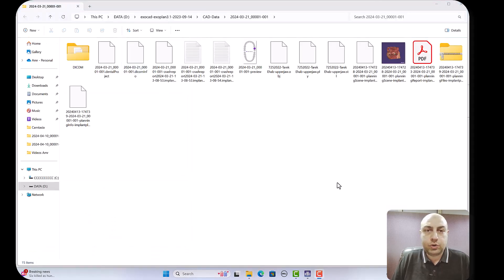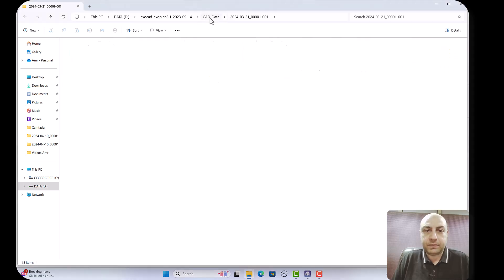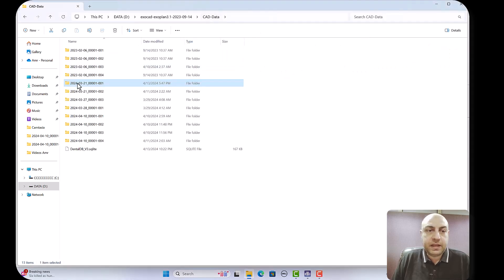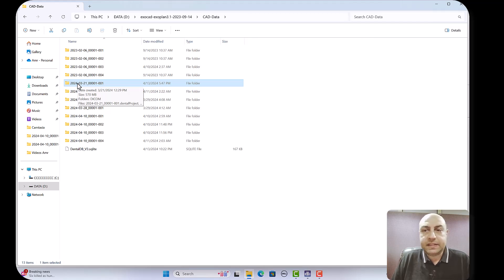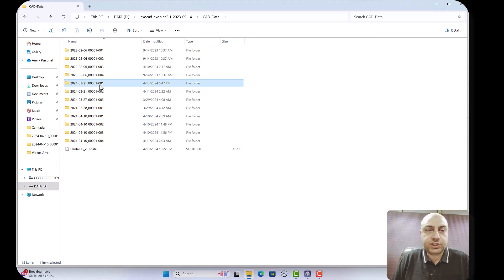Just go one folder back, take this folder and copy it and keep it in a safe place or just copy it.